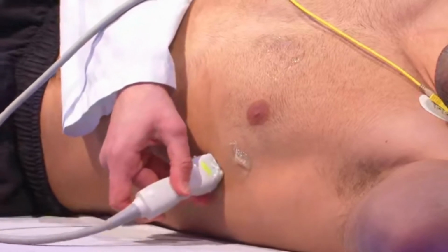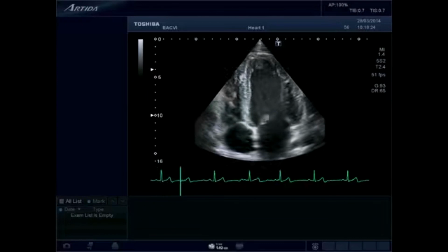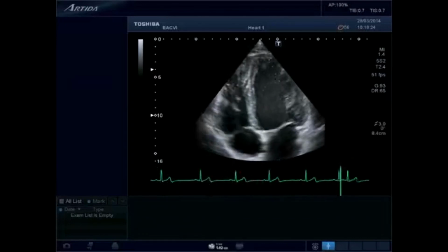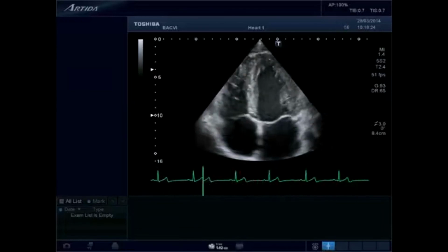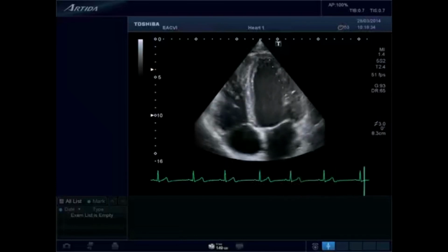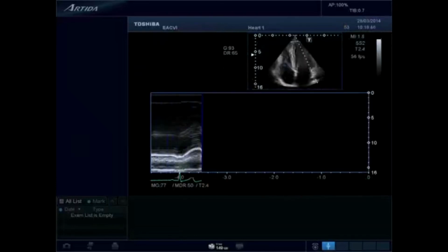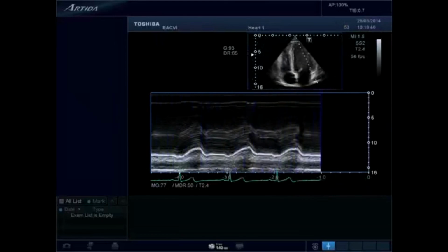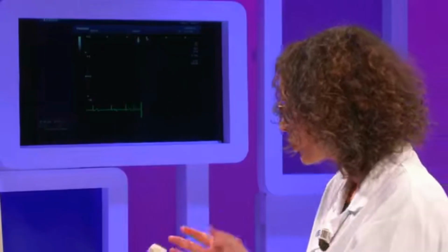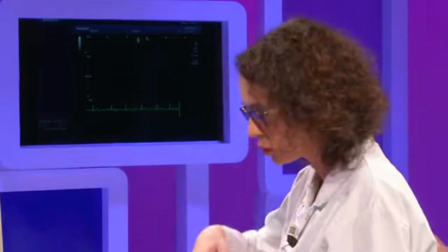On the mitral side, I will do absolutely the same, but at the mitral annulus, and I will obtain the MAPSE. So here I'm really careful to be at the junction, and I will do the M-mode acquisition. Okay, and I can also measure here the systolic excursion of the mitral annulus. Okay, so now let's move to the subcostal view, so I will ask you to go again here.